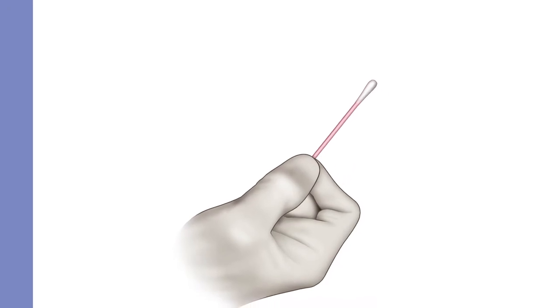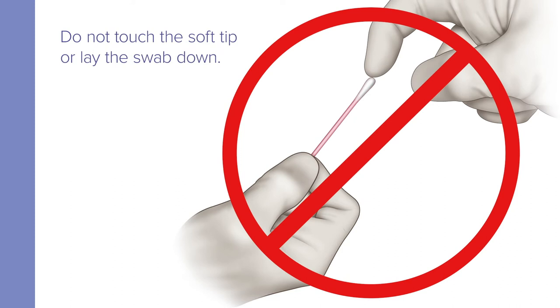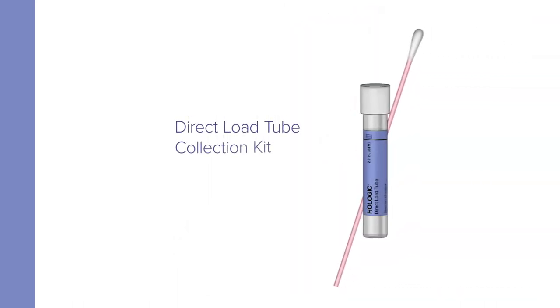Begin by removing the swab from the package. Do not touch the soft tip or lay the swab down. If the soft tip is touched, laid down, or dropped, discard it and get a new direct load tube collection kit.